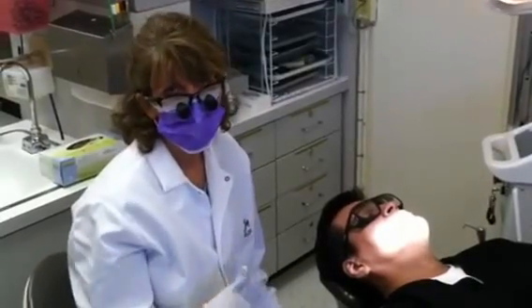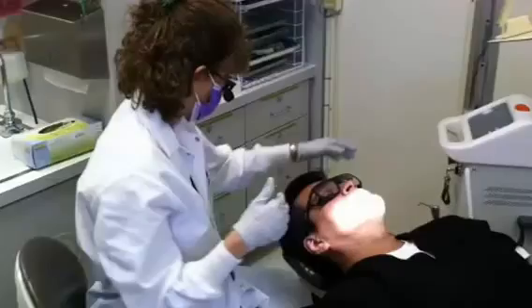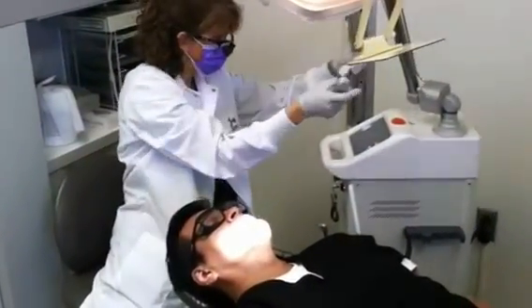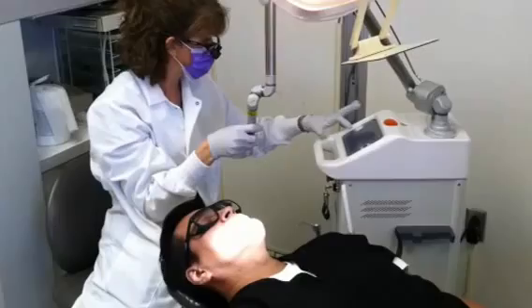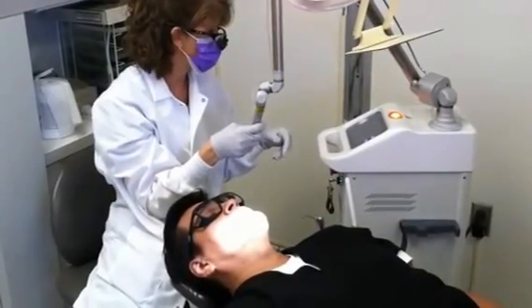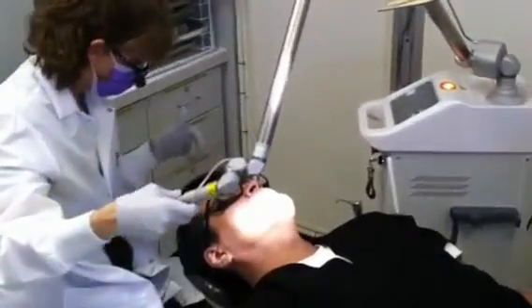Hi, I'm Joy Glaser. I'm working on my study here at Weaver State. We're treating cold sores, and we are going to use the laser — level 5, level 4, frequency 50 — with the periotip in, which cuts the power down by two thirds, about 0.5 watts to the tissue.